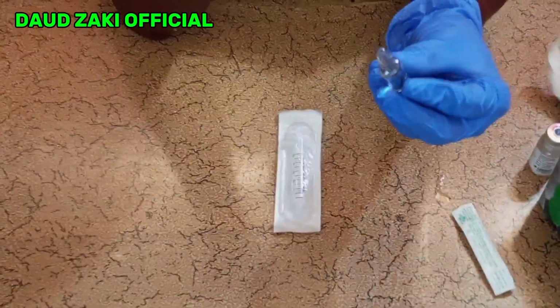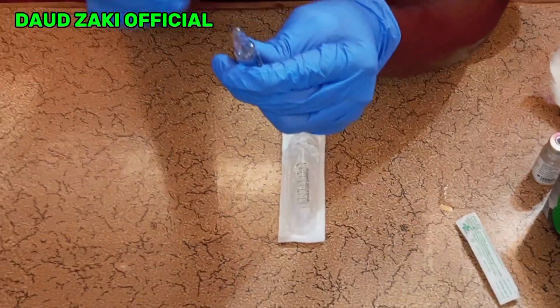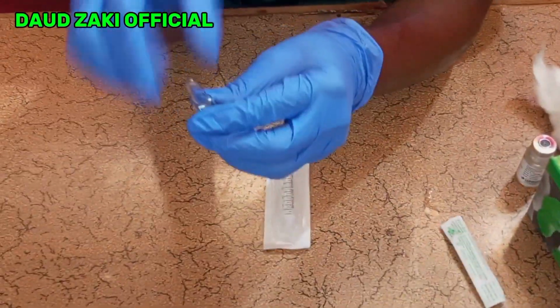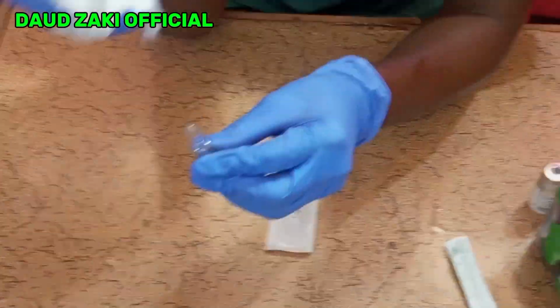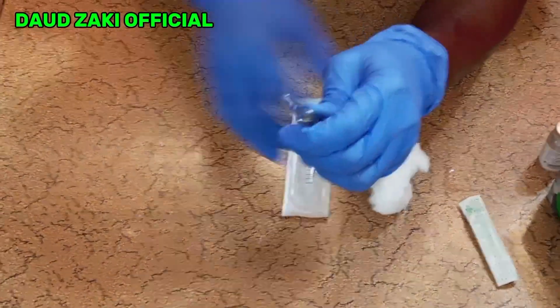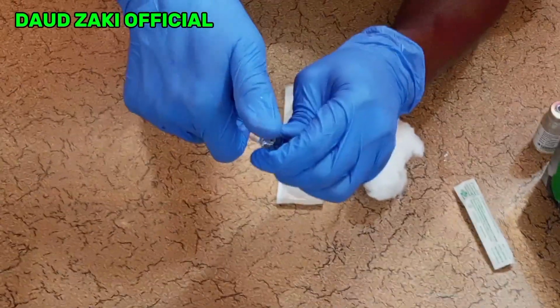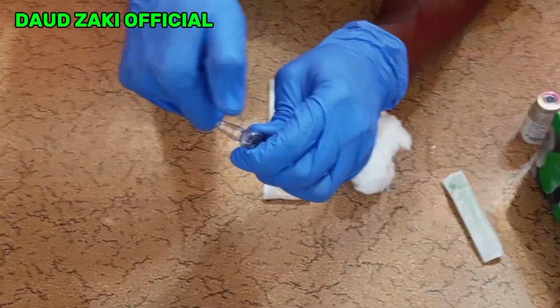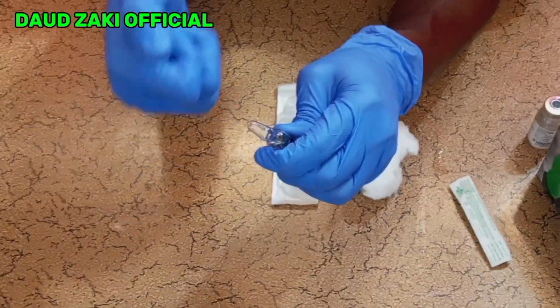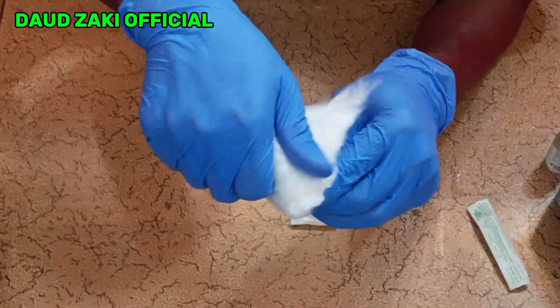Before you start withdrawing from the ampoule, make sure that all the drug is at the bottom of the ampoule, not at the top. So this is how you are going to break it. You can use gloves or cotton wool. You hold it with your thumb and index finger pointing to the dot of the ampoule. Then you pull it downwards. You can use anything to hold it, to avoid injury.